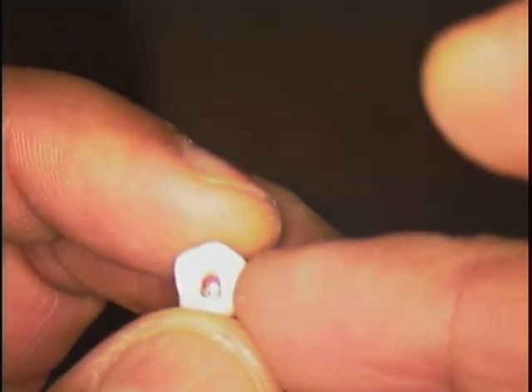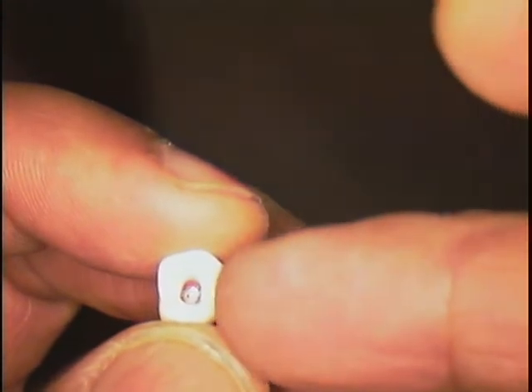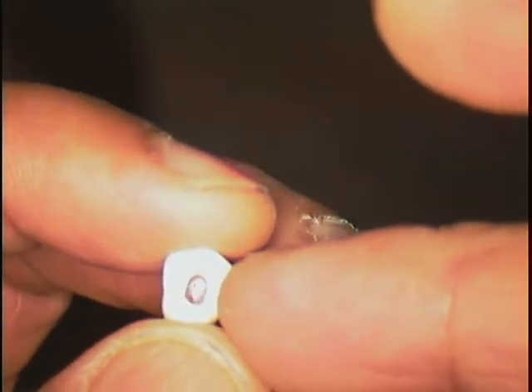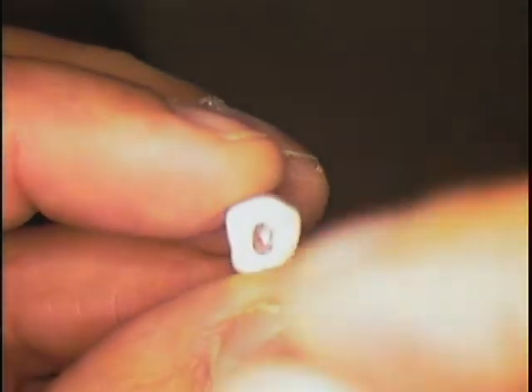And sometimes they'll leave an orifice open if it's draining a lot, and then they'll come back and close it after the antibiotic has kicked in, because you might have pus coming up from this and bacteria. So that happens quite often as well. So it's really interesting to the anatomy to find out, hey, I can find little things in there in the amount of detail. Try that again.